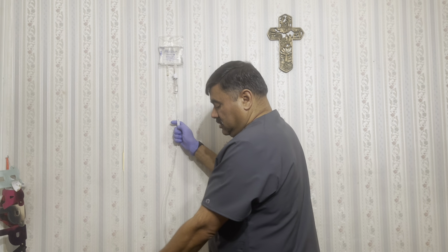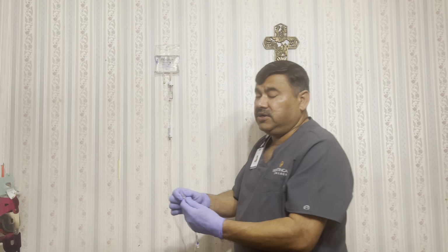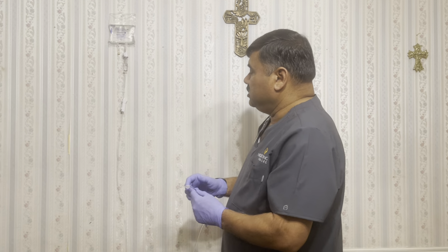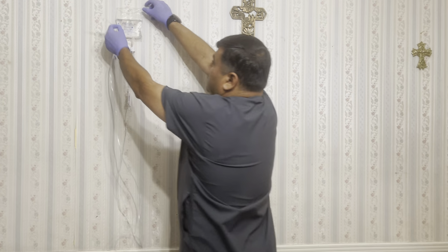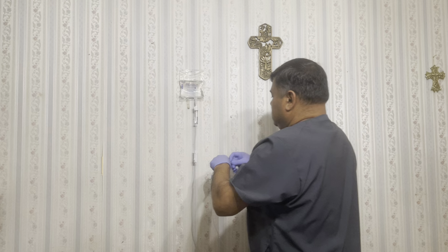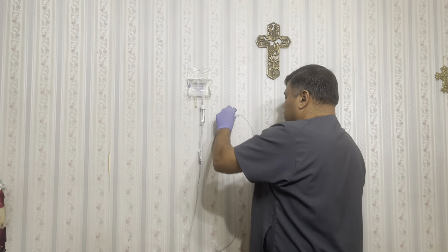Now I'm closing this. So I counted 38 drops per minute. Here I want to remind one thing. When I'm hanging my IV, I will make sure that it is 30 inches above my patient's IV, like their IV cannula. So that should be 30 inches higher than that. Now I'm adjusting my pole, just adjusting here.